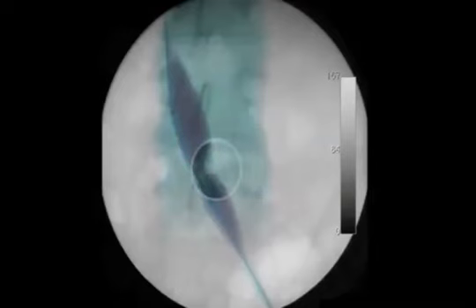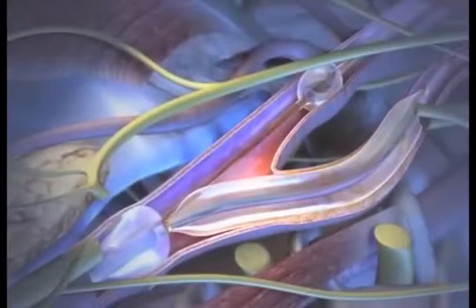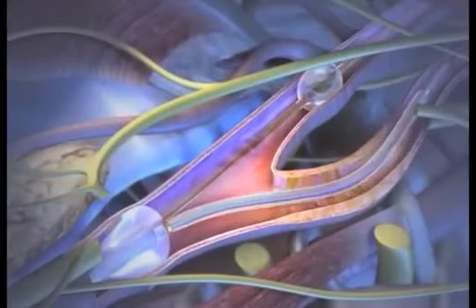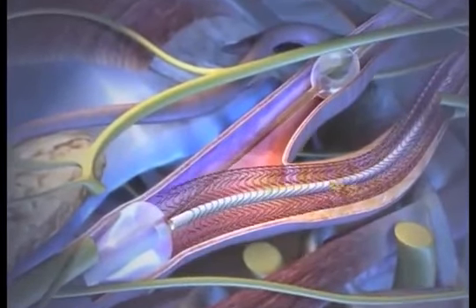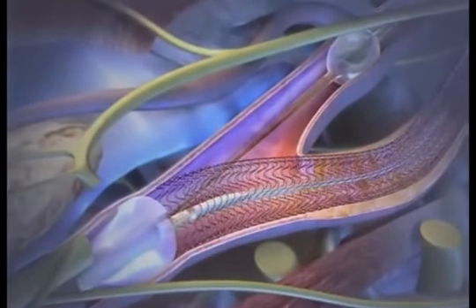That means as the balloon is expanding, it's being constrained by that iliac vein compression site. And as we blow it up to 2 atmospheres, it's going to spring open that area of compression. If you balloon only, the lesion will recur. So what we do then is we stent it.